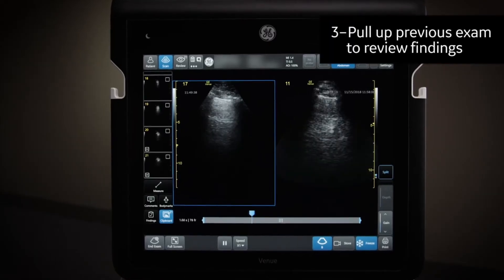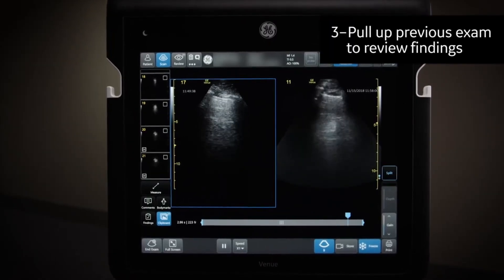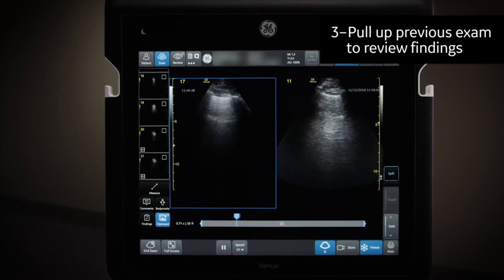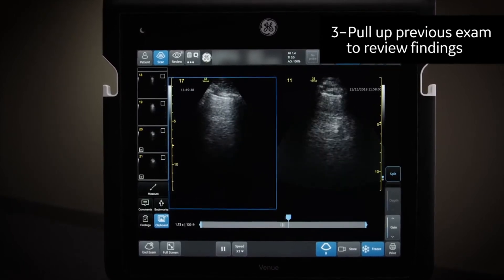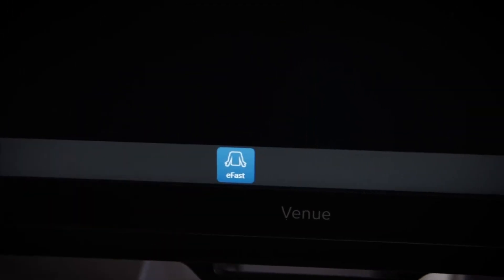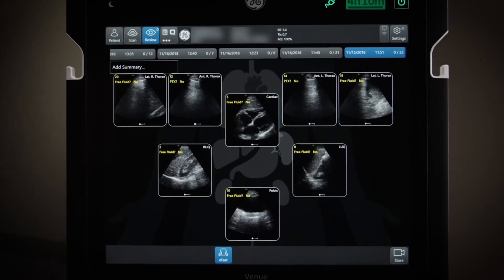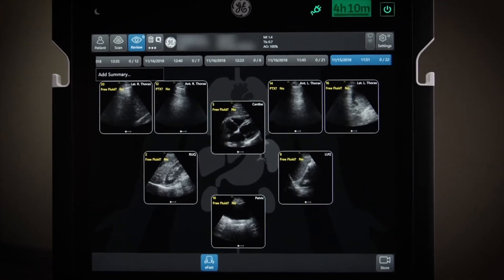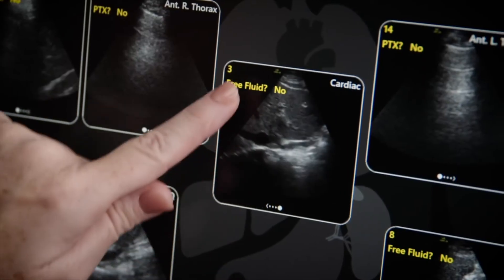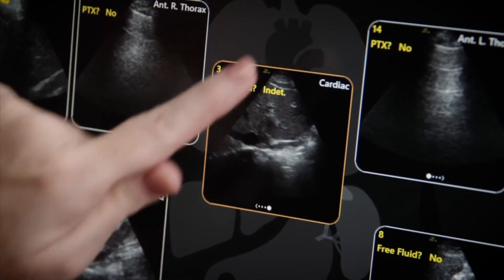When repeating an exam, simply pull up a previous exam to review findings and images side by side. Need to modify an exam? Pull up the patient's eFAST diagram overview and easily change the status with a tap of the screen.